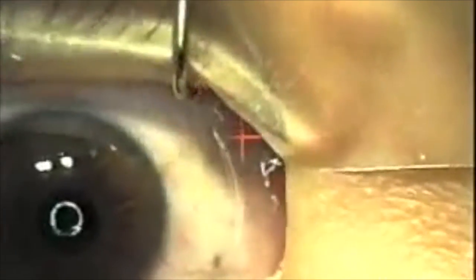So here we have a video of an actual LASIK surgery being done, and I'll be going over the procedure and the different parts that we went over in our presentation. So by this point, the numbing drops have already been placed, and the lid speculum is about to be added, separating the eyelids from the actual cornea. And the paper there is to protect the eyelid from the lid speculum.